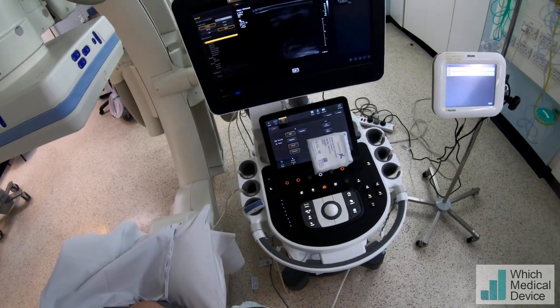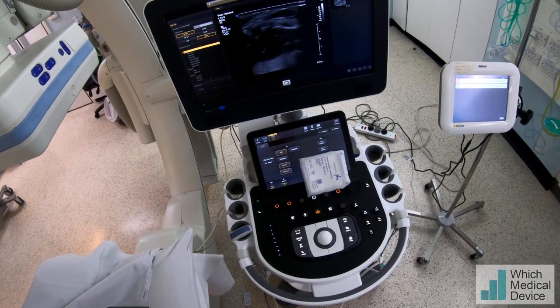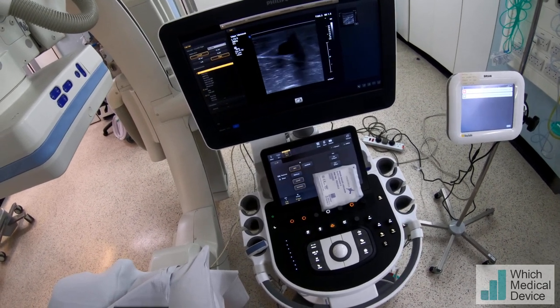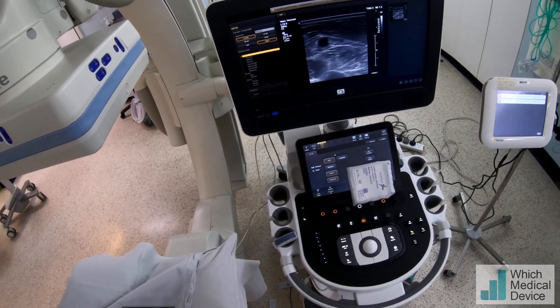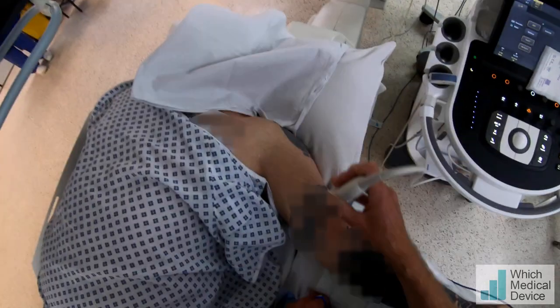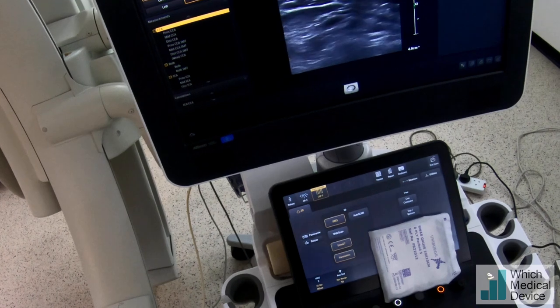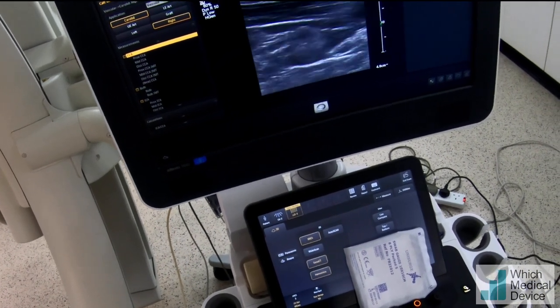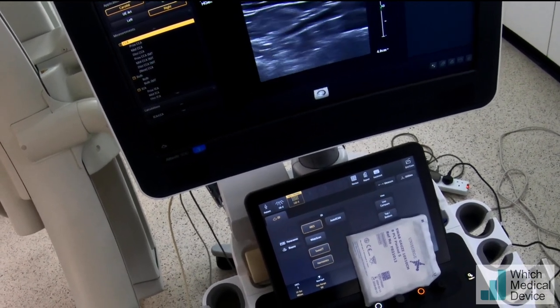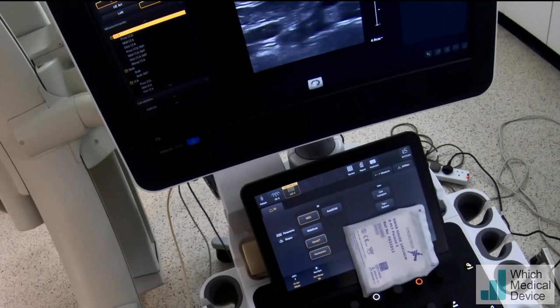First of all, just going to ultrasound his fistula. There's the arterial anastomosis which looks fine. The proximal venous side is fine, so we're just going to follow the draining vein all the way up his arm towards the shoulder. Coming round towards the cephalic arch — just need a bit more jelly on there — and you can see here, going longitudinally, there's a narrowing. I suspect this is at the area that was plastied just eight weeks ago. You can see it really is quite narrow, and then it flares out and opens into the subclavian vein.